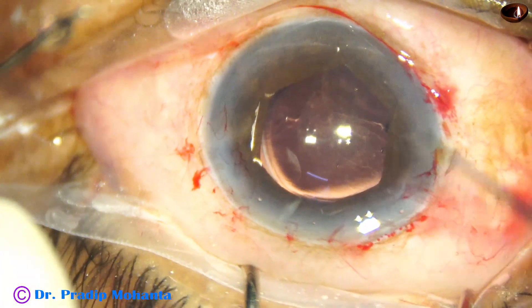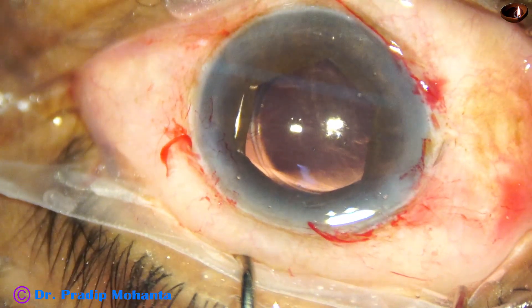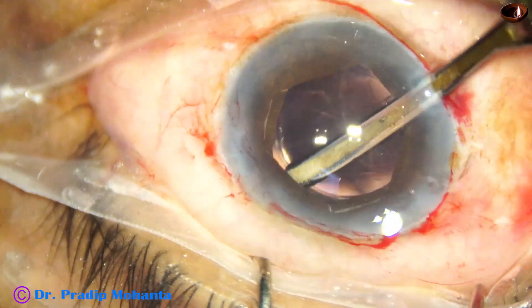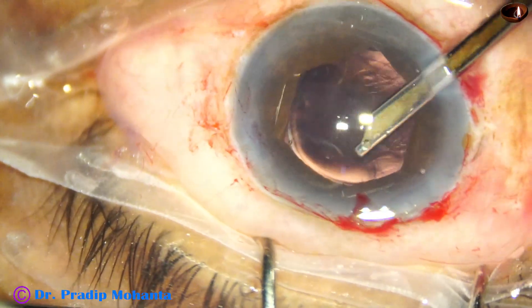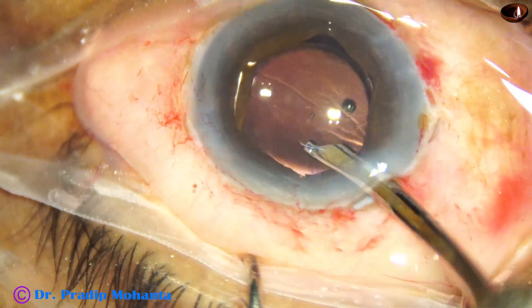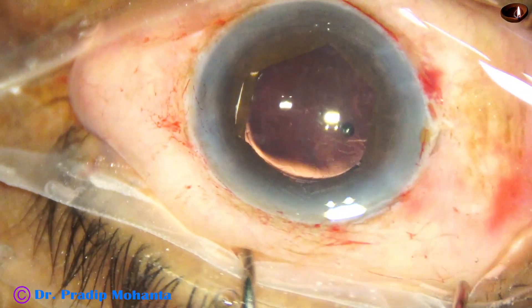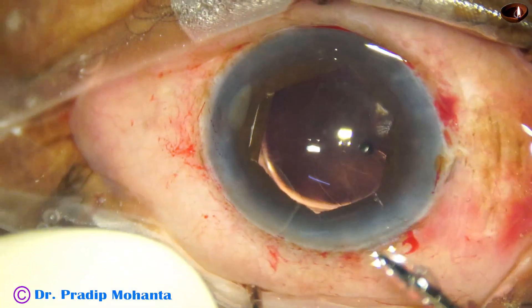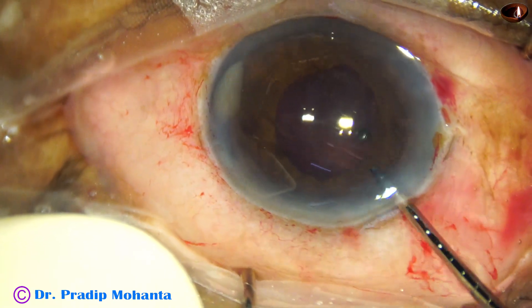Visco again. The eye hook is being used to see if there is any cortex left anywhere. There is some cortex here, as I saw using the eye hook — remove the cortex. This B-Hex can be removed under irrigation, but I prefer to remove B-Hex under visco, so injecting visco. Use the B-Hex forceps, disengage — hold on the side of the B-Hex and remove it.